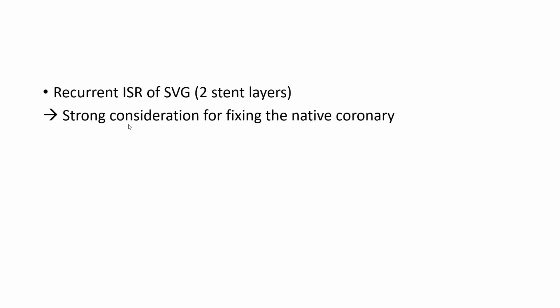Another idea, if you have recurrent in-stent restenosis of vein grafts, so 2 stent layer in-stent restenosis, strong consideration for fixing the native coronary if you have CTO skills, or refer them to a CTO center.